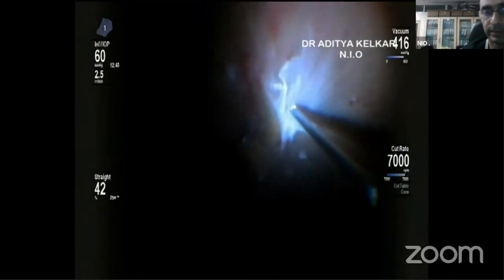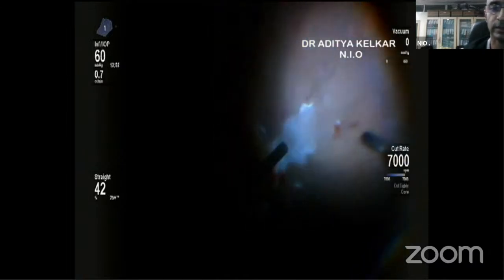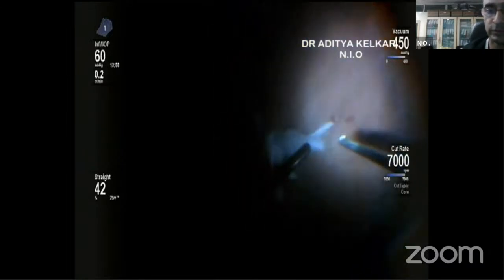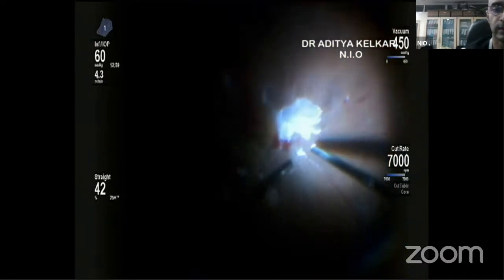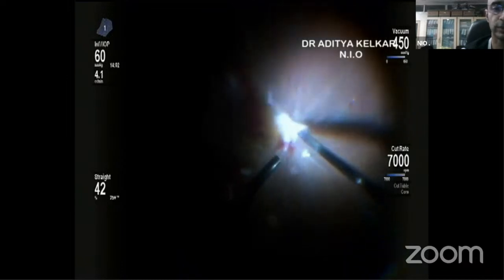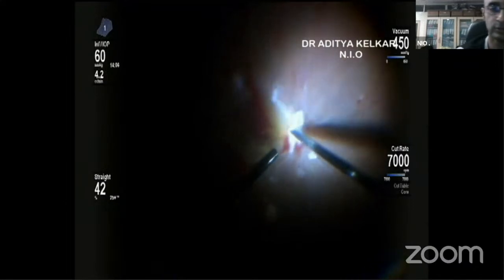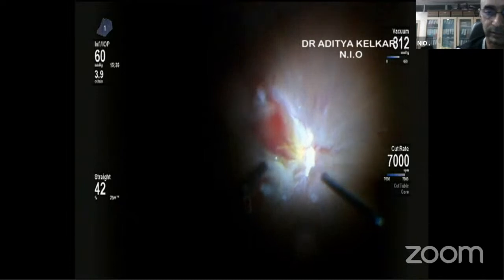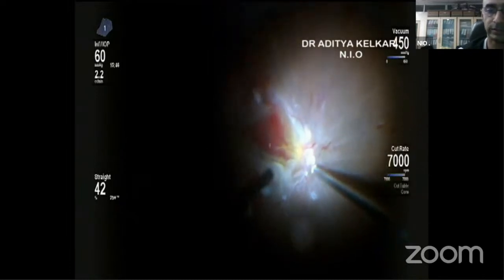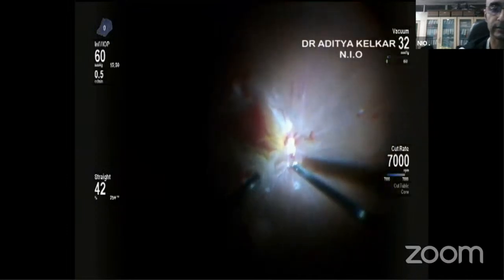At the same time, the entire surgery could still be carried out using a three-dimensional digital microscope. Initially, we had issues with the learning curve with this microscope to visualize the membranes or to identify the dissection planes. And whenever there was any bleeding on the posterior pole, identifying retinal tissue underneath the bleeding used to be difficult. But with time, we are getting used to this technology more and more and have started liking it as time passes by.